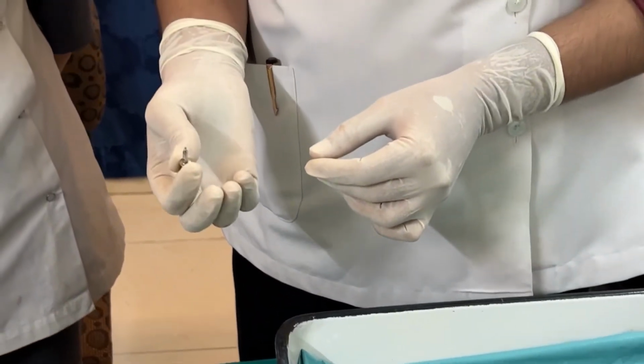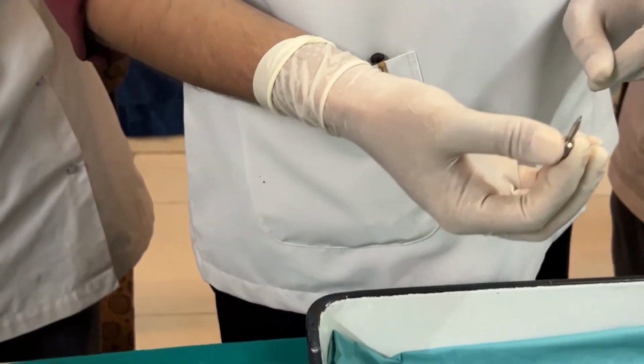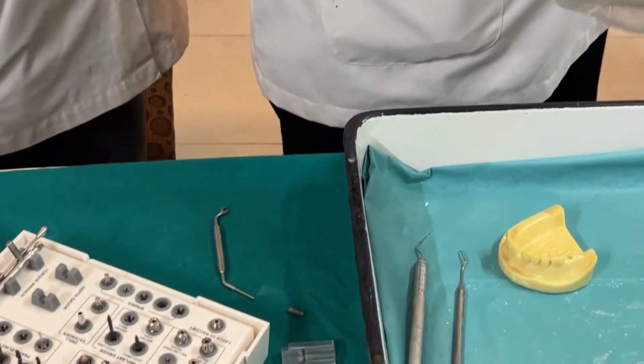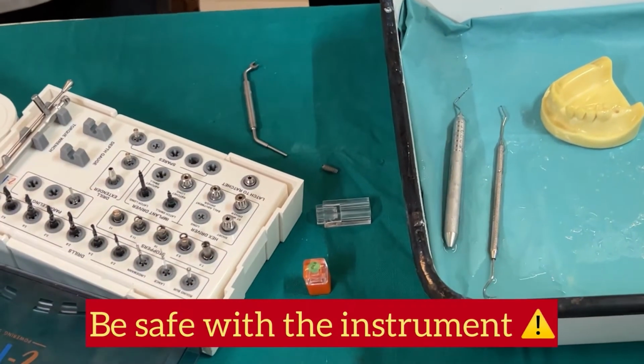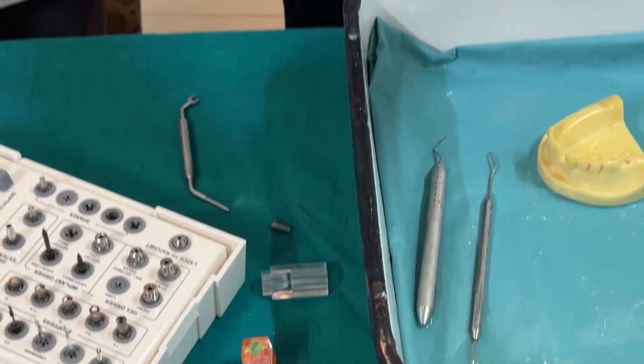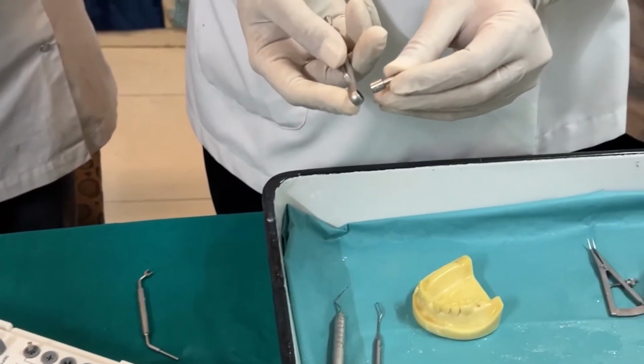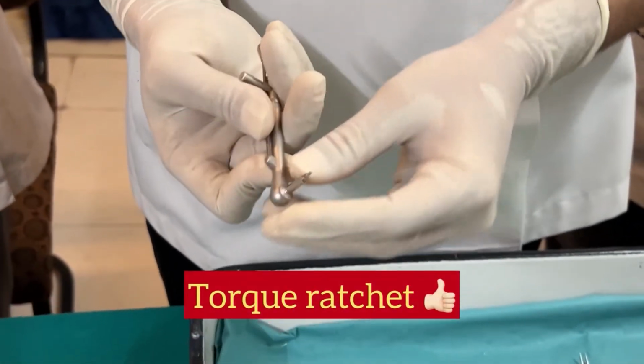Implant is surgery first, prosthetics much later. So the rule of surgery is safety first. So never ever leave any instrument unattended in the patient's mouth. Otherwise the patient will end up swallowing that instrument. So the rule is always and always engage this extended mount into the torque ratchet first.